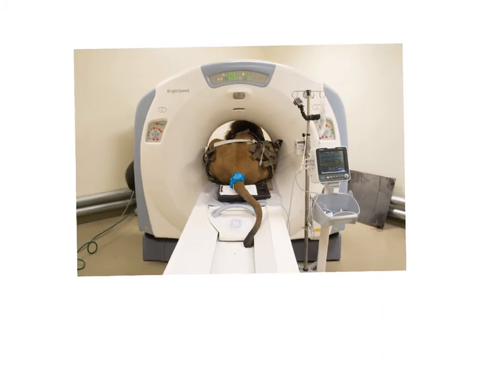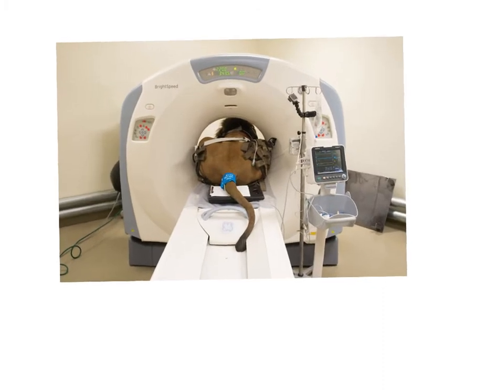Okay, so this is a CAT scan. You can see there's a lion sitting there. So what you have is a table. This is the table here that moves in and out of the gantry. The gantry is this bigger structure. The table is capable of moving in and out of the gantry. The X-ray machine is actually in here around it, and it spins around, and we're going to talk about how that works. But that's just a general image of the CAT scan and how it looks.